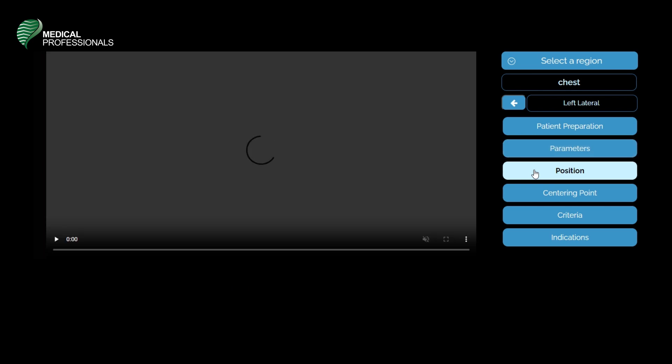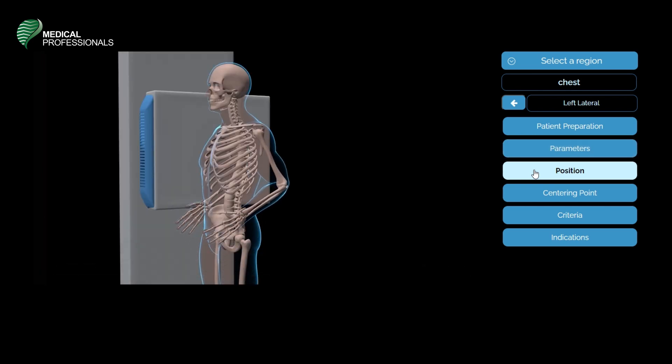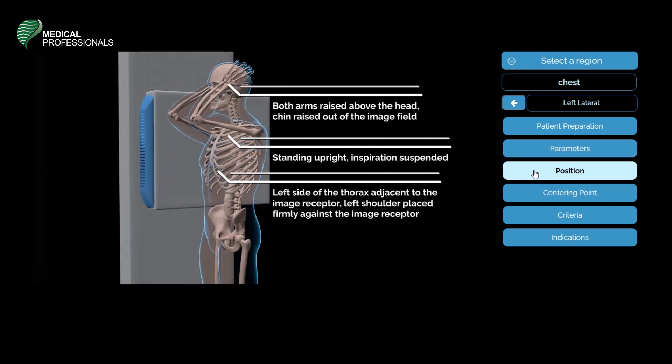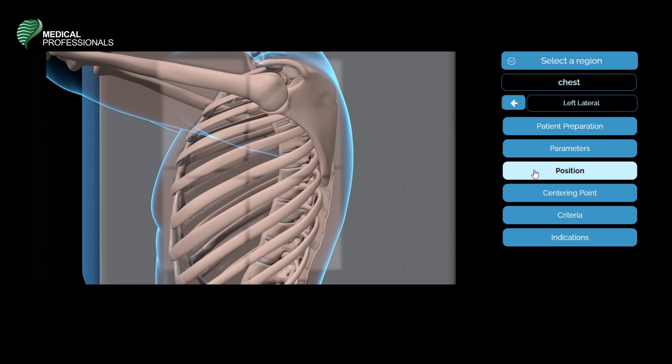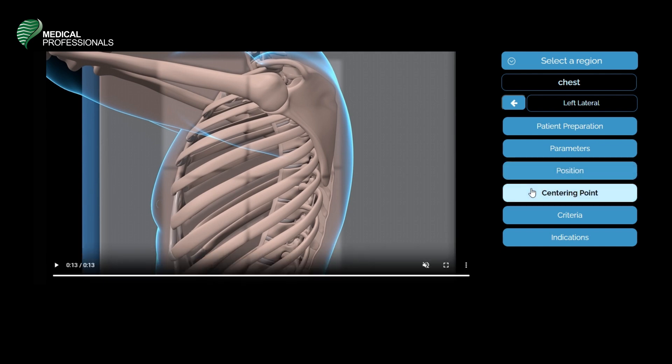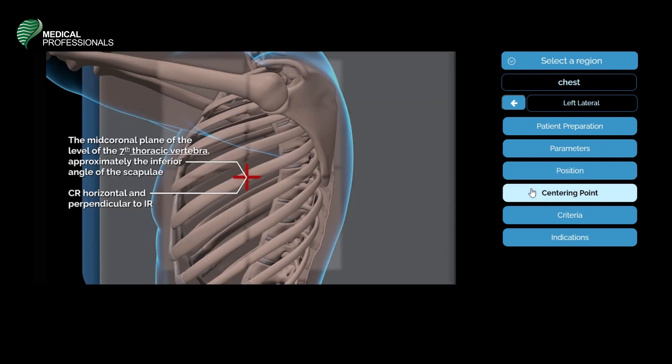The patient position for the lateral chest: both arms are raised above the head, and the patient's chin should be raised out of the image field. The patient should be standing upright with inspiration suspended. The left side of the thorax is adjacent to the image receptor, with the left shoulder placed firmly against it. The central ray will be horizontal and perpendicular to the image receptor, at the level of the seventh thoracic vertebra, approximately the inferior angle of the scapula.